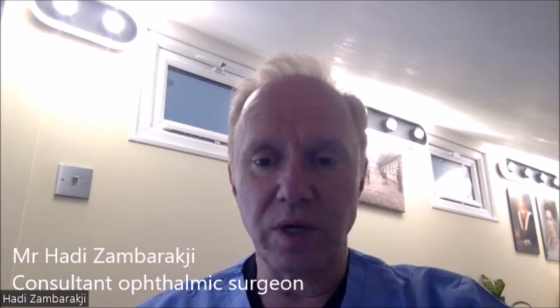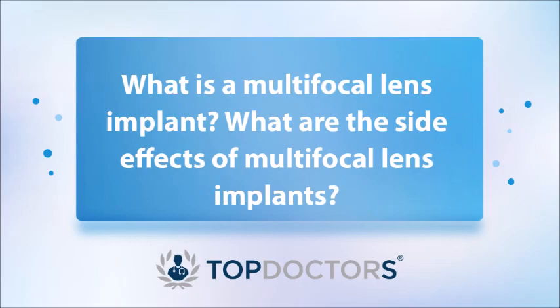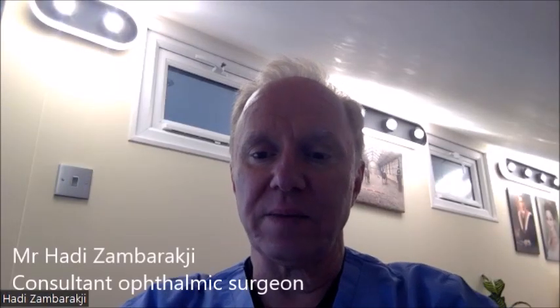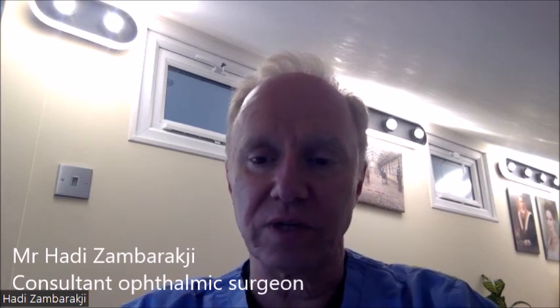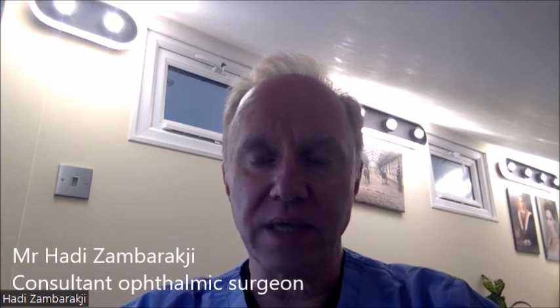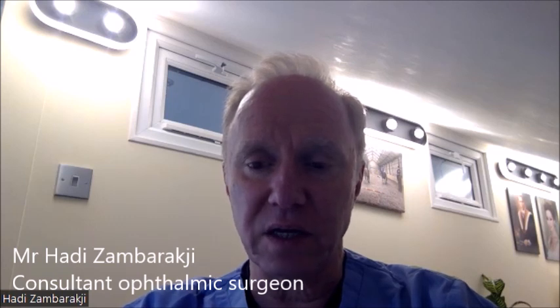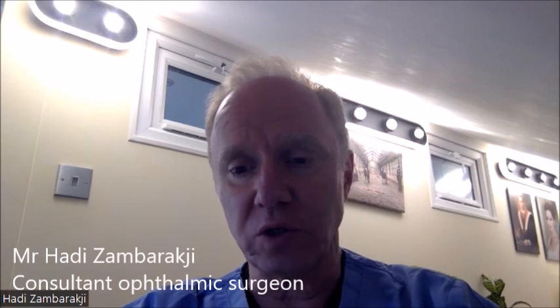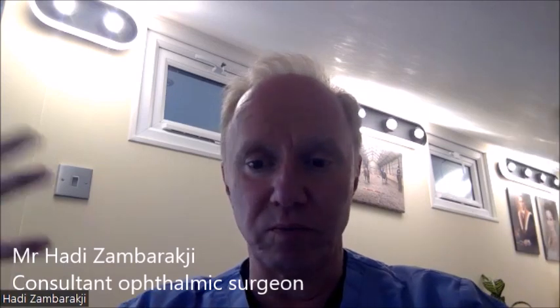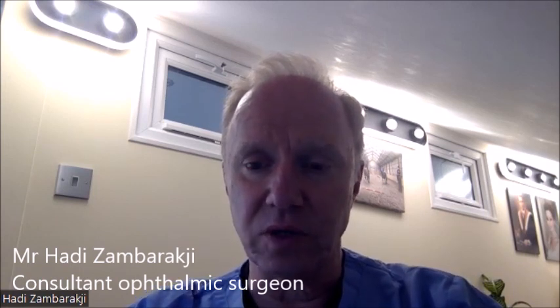So, in summary, there are two ways: are they multifocal lenses, or enhanced monofocal lenses using monovision correction? As I mentioned earlier, a multifocal lens implant is a lens that is designed to give multifocality and therefore vision at multiple distances. The main side effect profile of these multifocal lenses is that they can give the patient halos and glare, which can be quite disturbing, particularly at night. But they can also induce dysphotopsias, so abnormal bright lights, which patients usually notice at night, so in the dark.